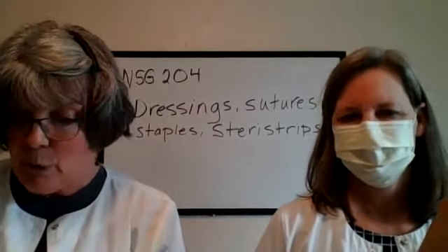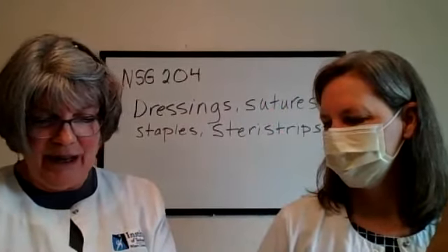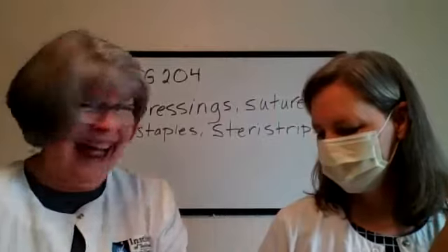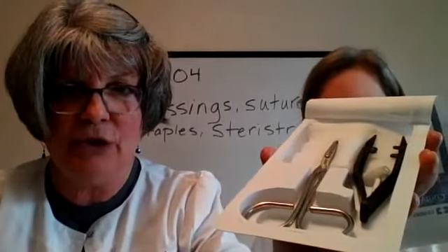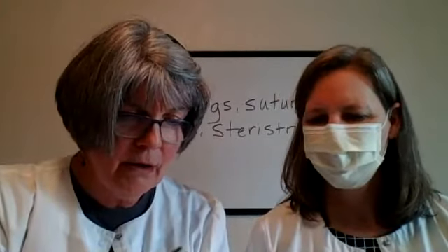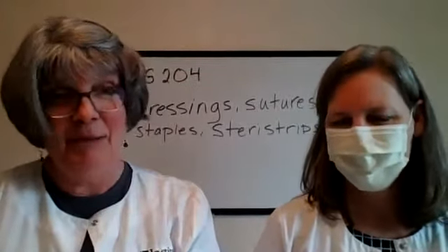We're going to start out with the suture removal first. There are wonderful little kits that have everything enclosed in there. They're really helpful. Hopefully I can show you what's in here without dumping it out. There are tweezers and scissors, and then there's some gauze in there as well, and alcohol. Is there an alcohol? Usually. I'm a liar. This is a cheap kit. That's why we have them.